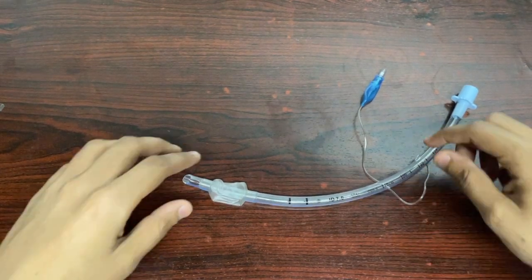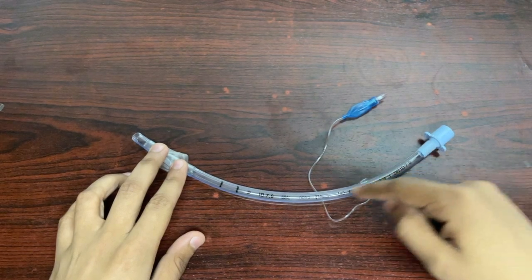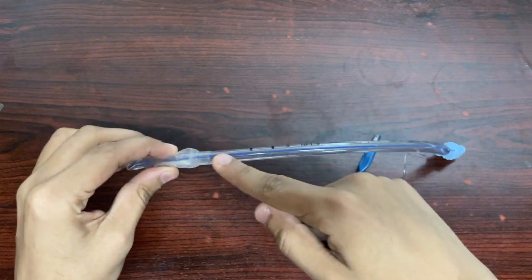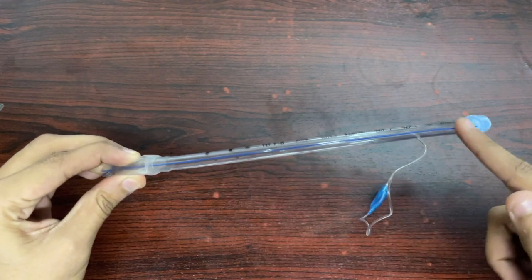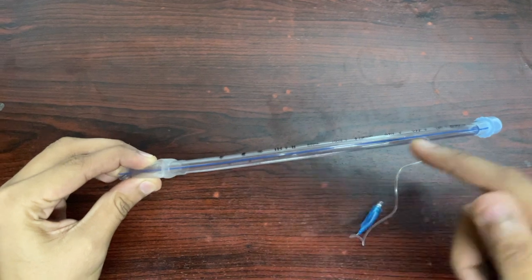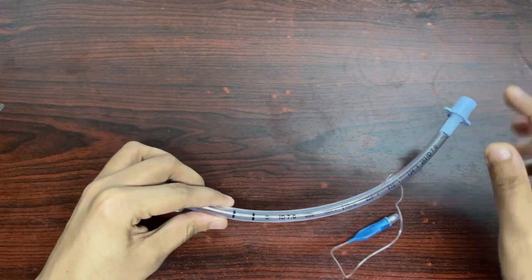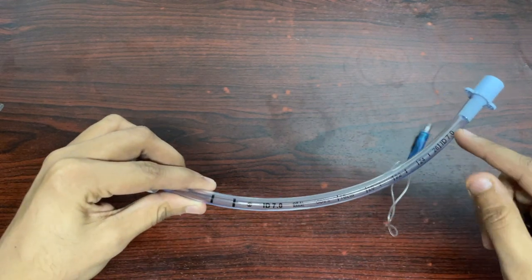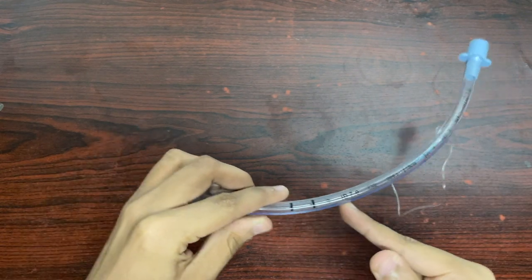Coming towards the endotracheal tube proper, which is having a blue radio opaque marking which is used to assess the position of the endotracheal tube via chest x-ray. Further, it is having various markings indicating the distance through the opening.